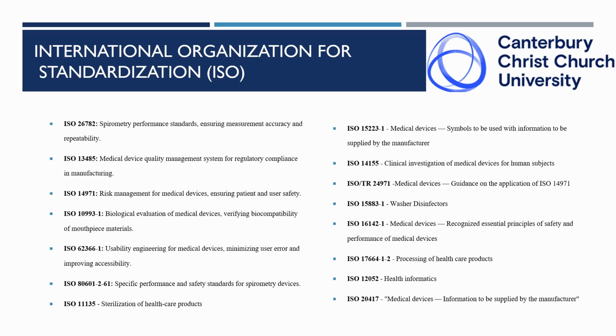Moreover, we've got risk assessment. Risk management is a critical focus. Standards in this area provide a framework for identifying and mitigating potential hazards associated with the device, protecting both patients and users. On the slide over here, we also have multiple bullet points showcasing multiple ISO standards that we have researched and included in the project.